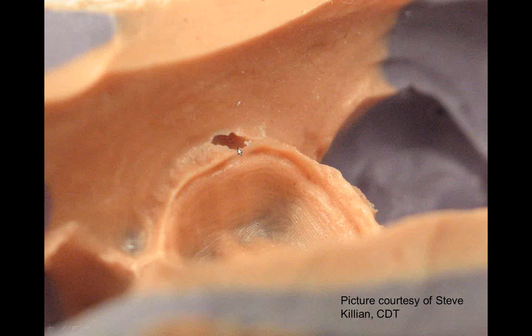Now, if you want to move forward with something like this, one of the corrections is to heat up some boxing wax, ortho wax, something that's really dead soft, has no push or pull, and be able to just drop it into that hole and close that off. All this area is going to get trimmed away by your model trimmer anyway, your die trimmer. And if we can close it and keep stone from flowing down underneath there, then we might be able to save this case. In either case, it should be brought to the attention of the communicator, and the communicator brought to the attention of the doctor.